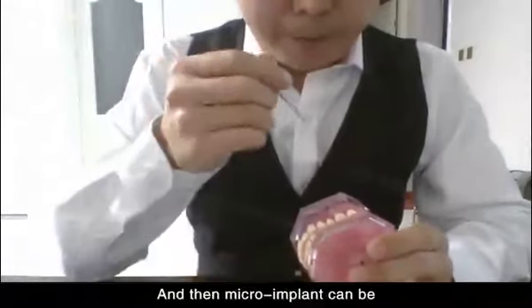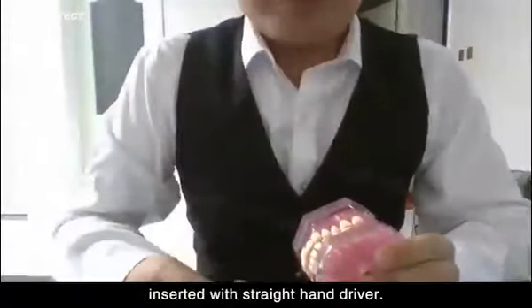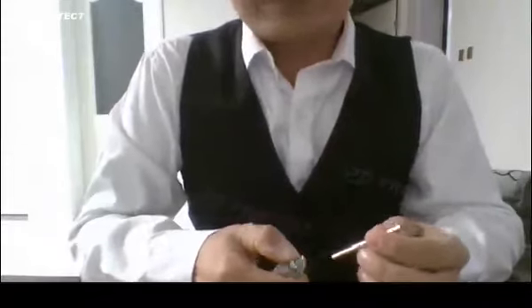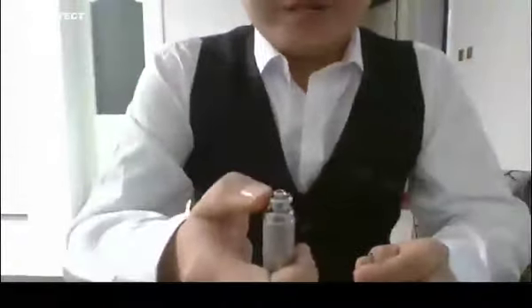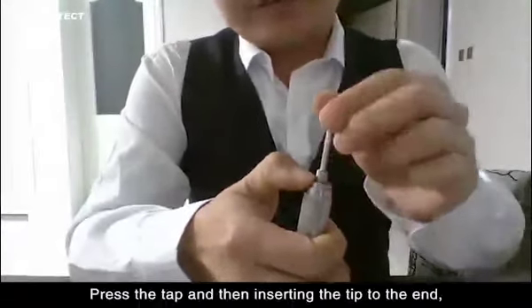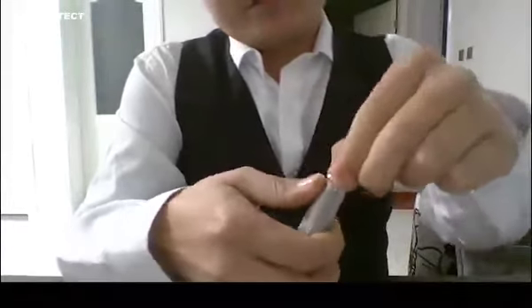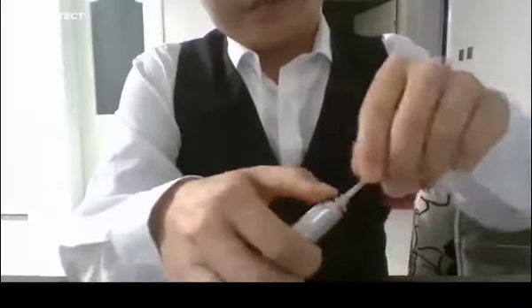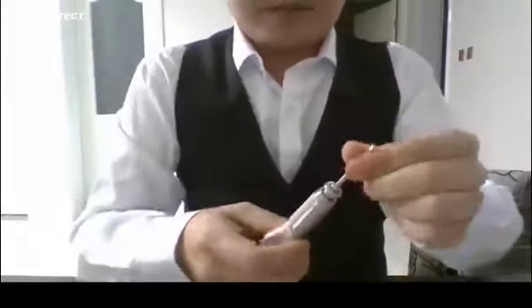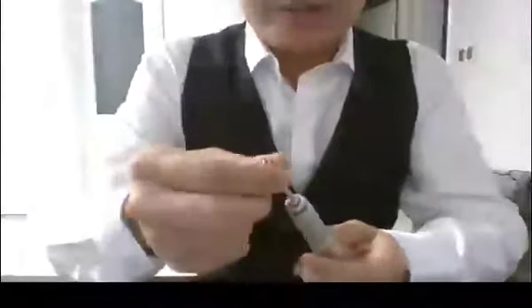And then, the micro-implant can be inserted with a straight hand driver. How to assemble the straight hand driver? Press the tab and then insert the tip to the end, then loosen the tab. It's okay. Check it. The tip cannot be extracted.